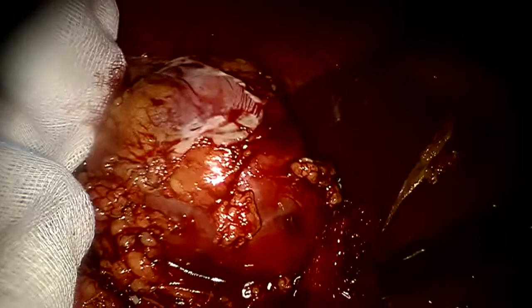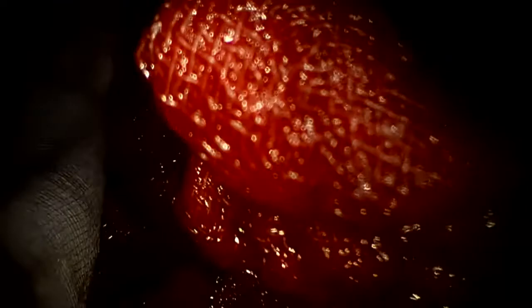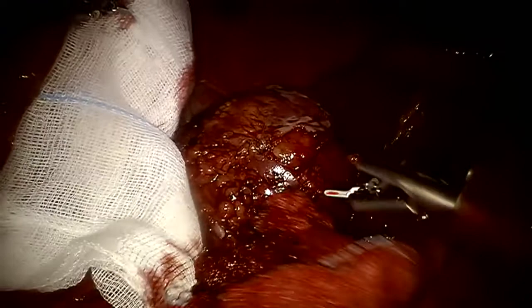Another one of these, please. You can take this one out. Your suction's not very good, that's why I'm doing this. Here you go, get this out. But the Stryker suction works like a champion, really does. It has high pressure irrigation, high pressure suction, and really does what it means.